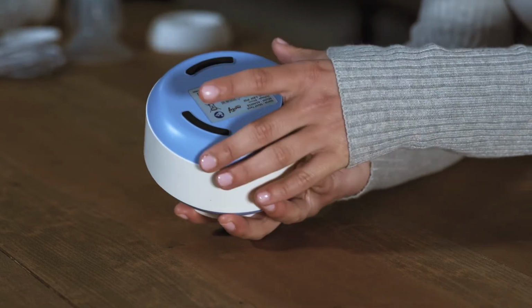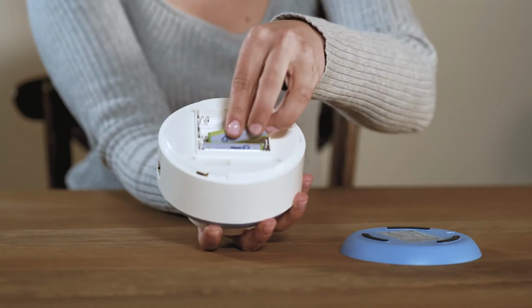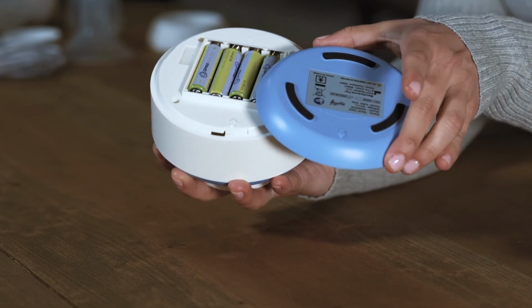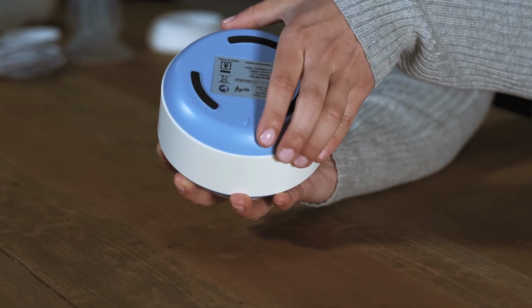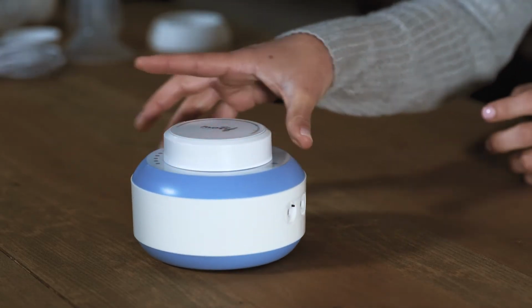Begin by opening the battery cover by rotating it to the left. Install 4 AA batteries and close the cover. Align the battery cover arrow with the arrow on the base and twist it to the right to lock. Ensure the cover is fully locked in place.